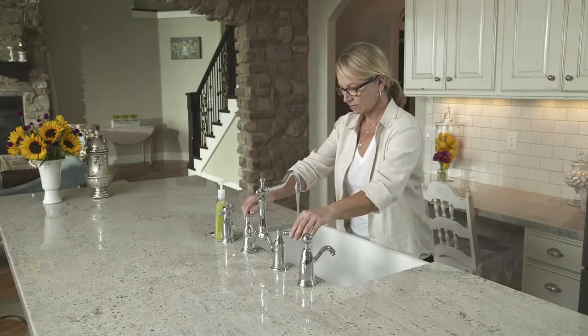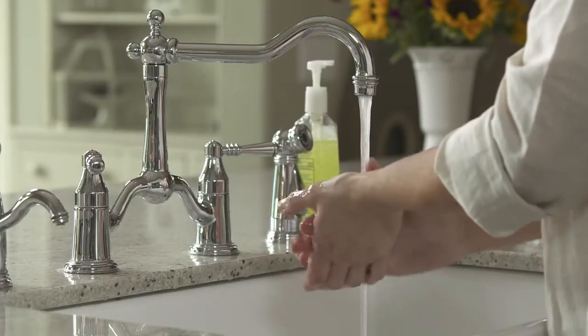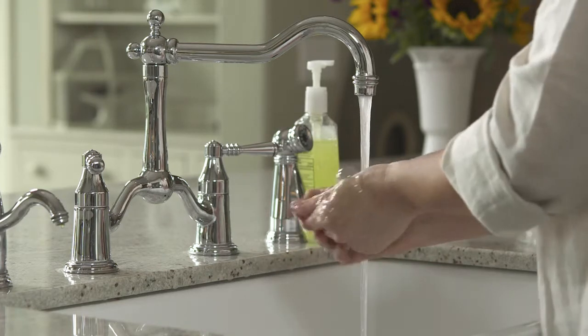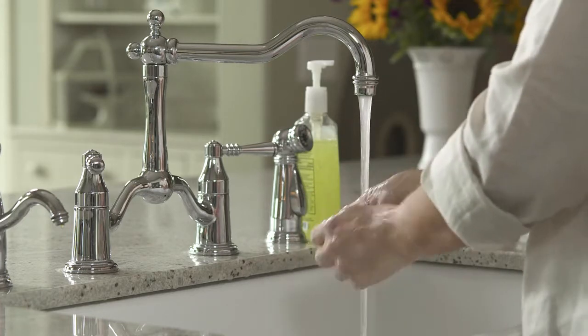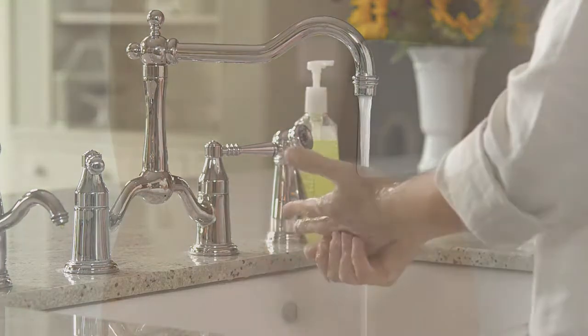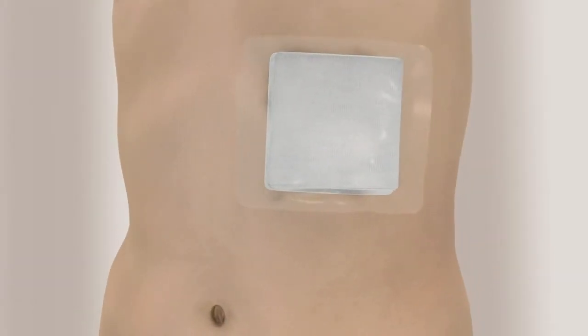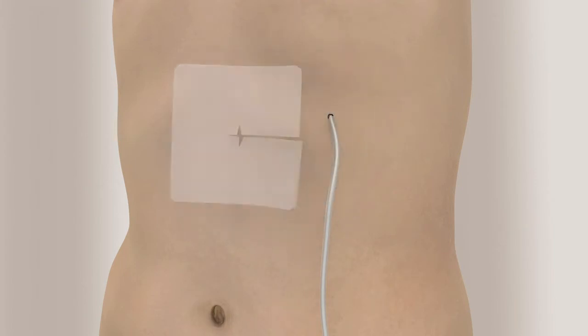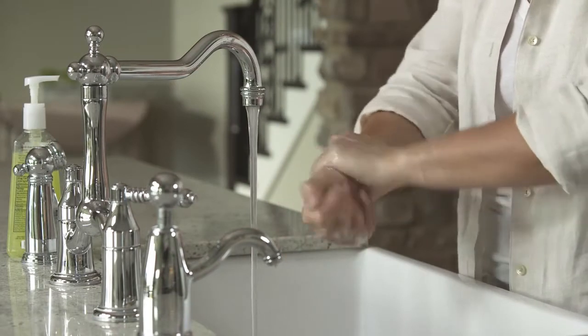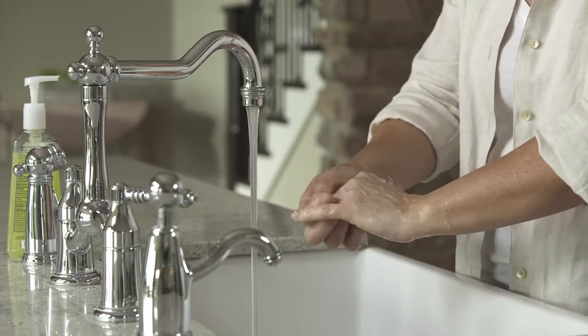Before beginning each drainage procedure, remove any rings and wash your hands thoroughly with soap and water for a full minute, even though you'll wear gloves during the drainage procedure. Dry your hands using clean paper towels. Remove the dressing from the area around the catheter and discard it. If you notice any redness or swelling around the catheter, any fluid leaking, or if the white cuff is visible on the outside of your body, continue the drainage procedure and then call your doctor or nurse to report what you see. After you've removed the dressing, wash your hands thoroughly with soap and water again for a full minute.